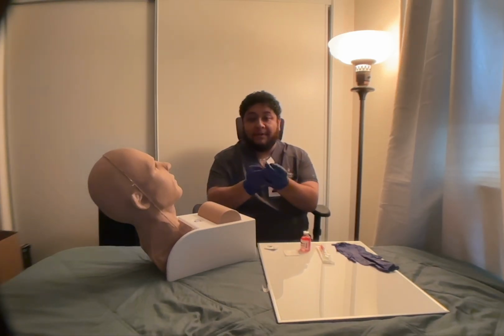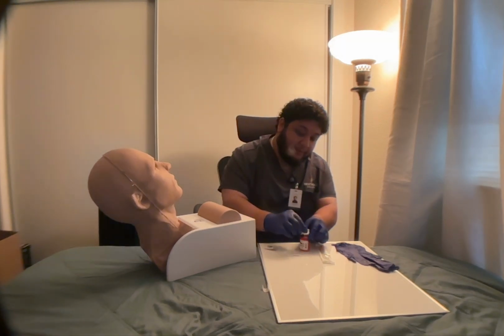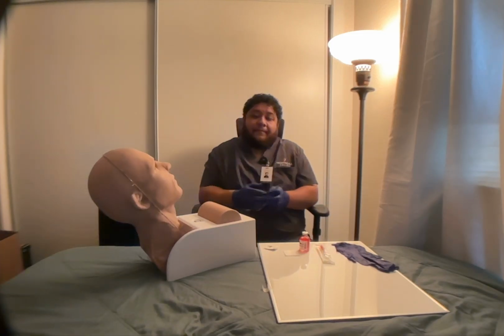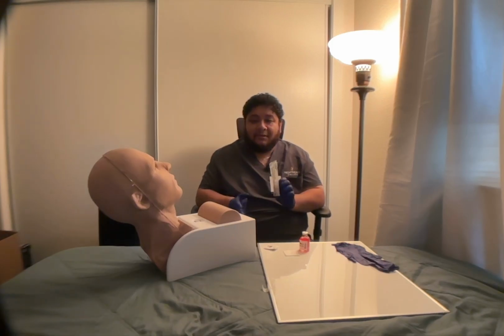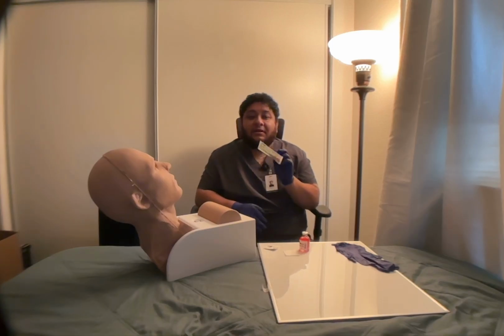I'm going to go ahead and discard my trash. Clean the top. Now that I've cleaned the top, I'm going to dispose of my alcohol swab. Okay, now the syringe that I will be using is the same tuberculin syringe. I'm using the same one because I was limited on supplies. It's a 1 milliliter syringe, 25 gauge, 5/8 inch needle.